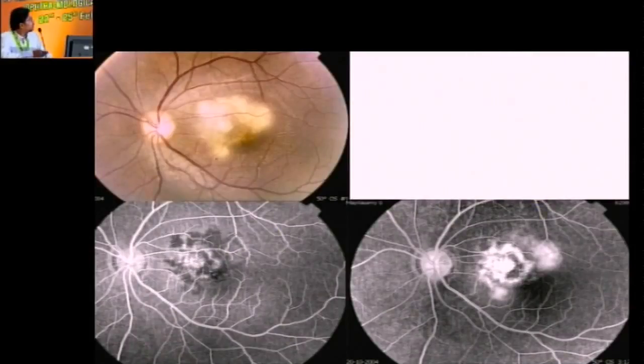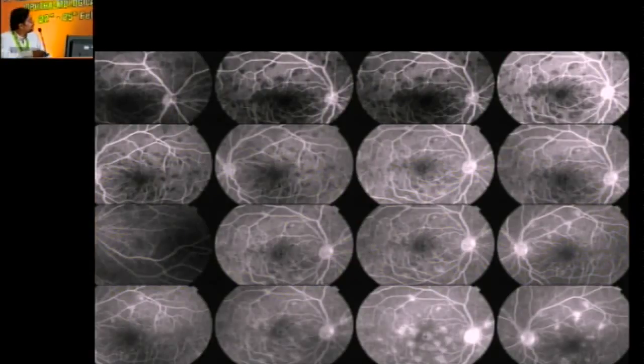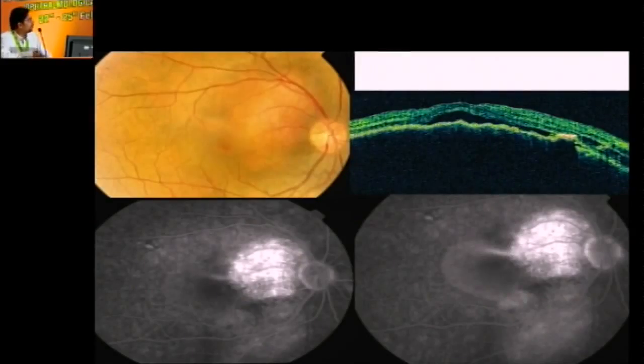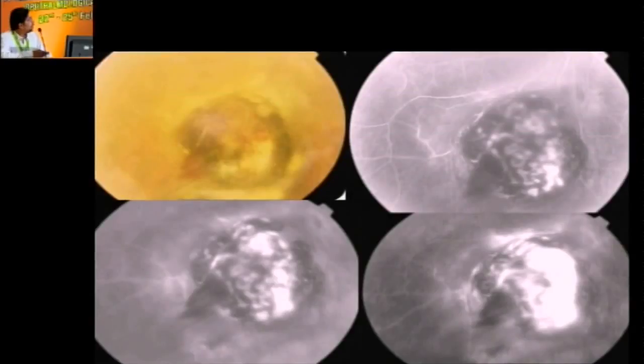And also inflammatory disorders, where you differentiate between non-inflammatory and inflammatory, where you have choroiditis, or when you have VKH syndrome, which mimics a CSR. Also APMPPE, which is again mimicking a CSR. So all these can be differentiated using fluorescein angiography. And there are some, mainly when you want to do this, a diffuse or localized choroidal hemangioma, where you want to do a PDT, or when it's a vascular proliferative tumor.